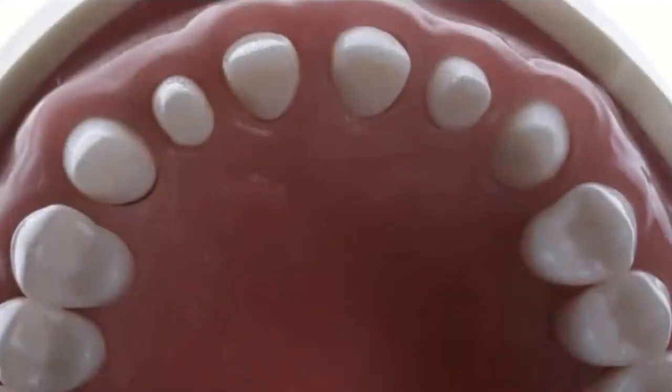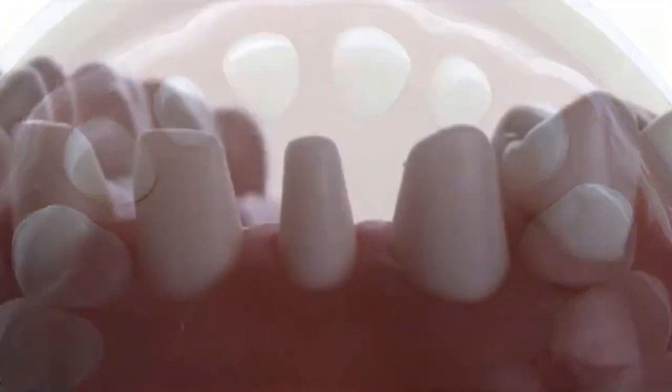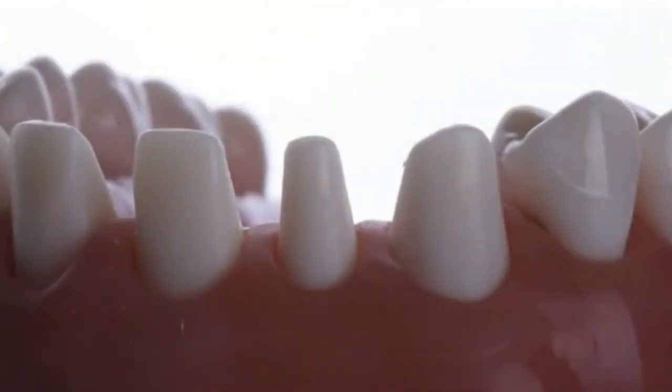So let me move myself away. The straight prep, again, is a modification. It's like a veneer prep, but there's no margin anywhere. It's just straight, and we are going to go about a millimeter on top of the CEJ. That's where we're going to put our margins. So there's no defined place for this margin. As you can see, my margins are way below the gum.